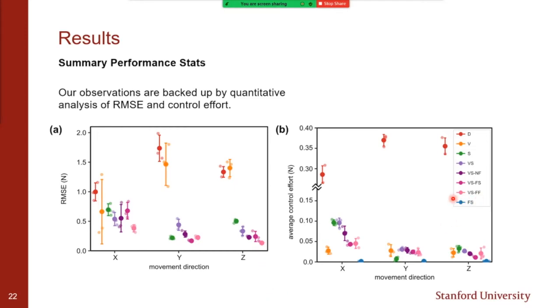And then for stability, the average control effort during the extreme holding positions, we see that the refitting also reduces the amount of average control effort. We think this is very prominent in the X direction, but less so in Y and Z, mainly because at some point, if the oscillations are small enough, the human hand manages to damp out a lot of these oscillations, though whether it feels good or not is a different story.